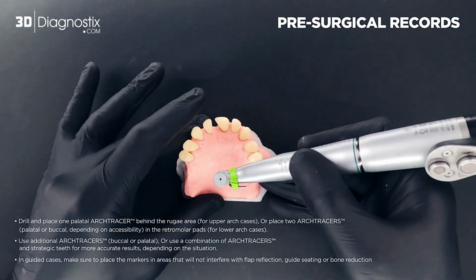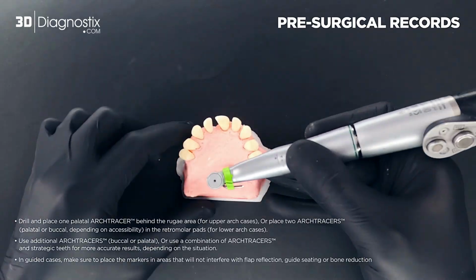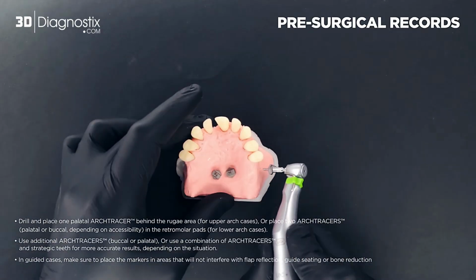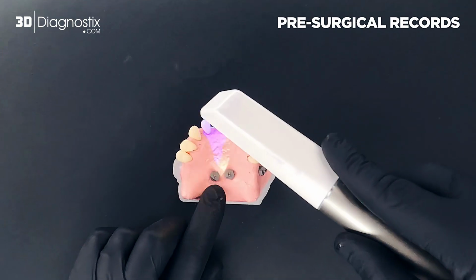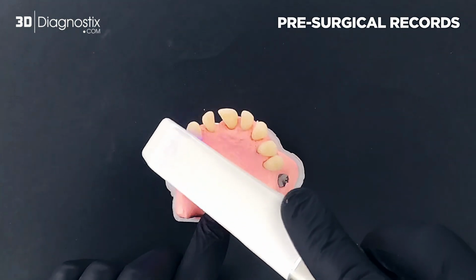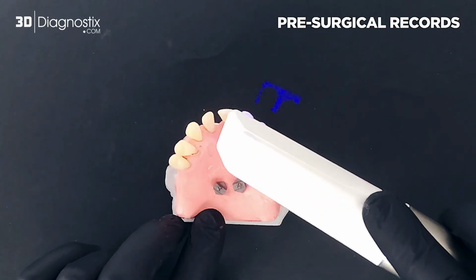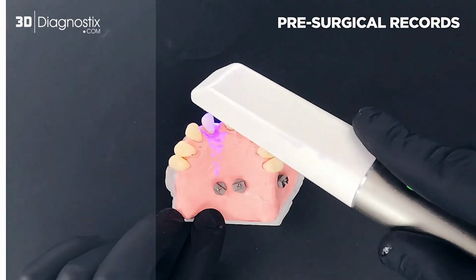Place the fiducial marker arch tracer first before registering the pre-surgical scan. For a maxillary arch case like this, we will use 2 markers in the hard palate and 1 in the facial vestibule apical to the guide. Then proceed with taking intraoral scans for the arch of interest with all available dentition, along with the fiducial markers, scan of the opposing dentition, and bite registration scan.